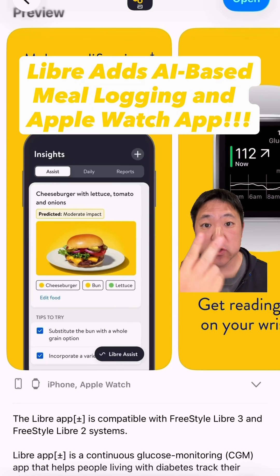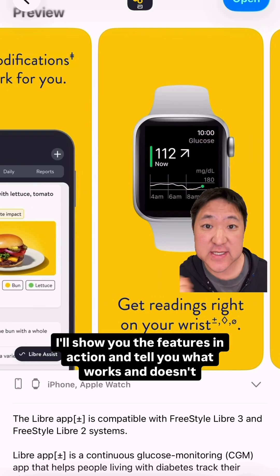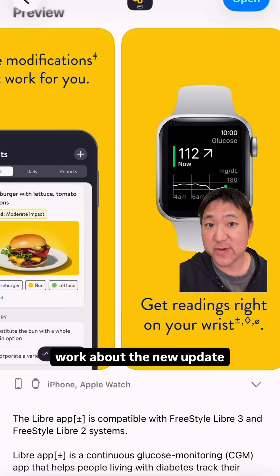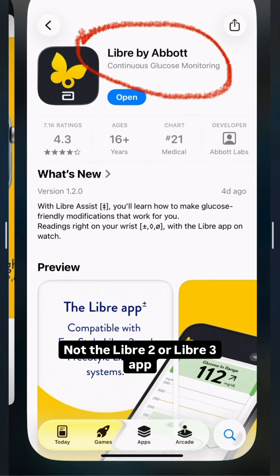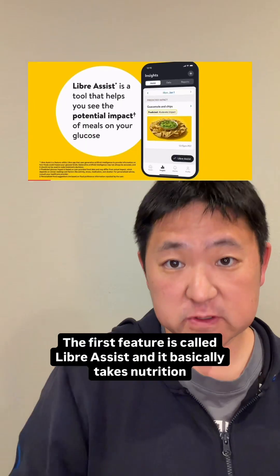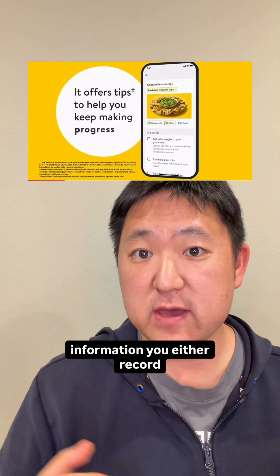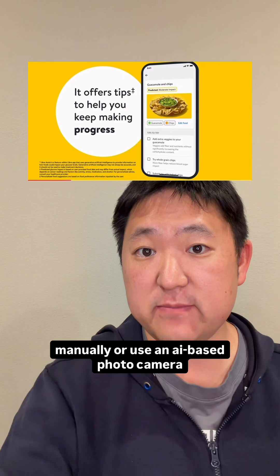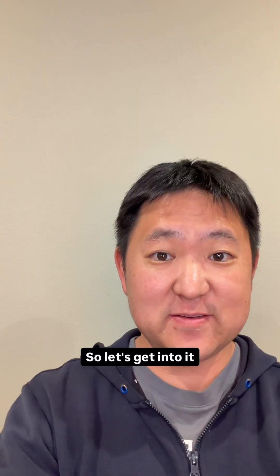Freestyle Libre just introduced two major new features into their Libre by Abbott app — not the Libre 2 or Libre 3 apps. The first feature is called Libre Assist, which takes nutrition information you either record manually or via an AI-based photo camera. The second feature is the highly anticipated Apple Watch app. I'll show you the features in action and tell you what works and doesn't work about the new update.